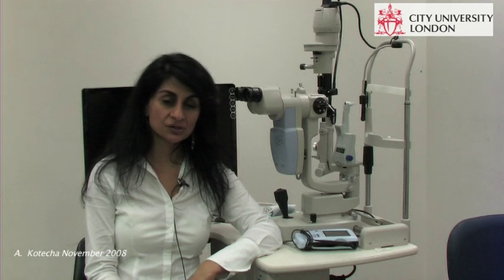In the previous teaching video, I mentioned that Goldmann applanation tonometry was a more accurate way of measuring intraocular pressure compared with non-contact devices. However, it's important that we distinguish between the terms accuracy and precision. The accuracy of a measurement refers to how close that measurement is to the true reading, whilst precision refers to the repeatability of the device. Because of the effects of the cardiac cycle on non-contact tonometry measures, it would be more correct to say that the Goldmann device gives a more precise measure of IOP.